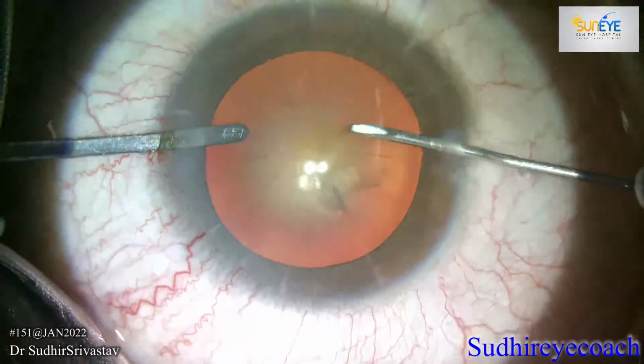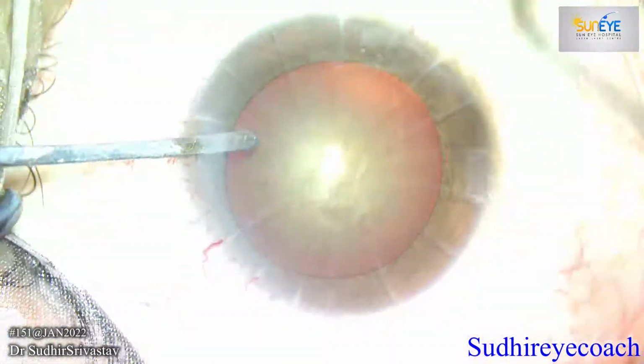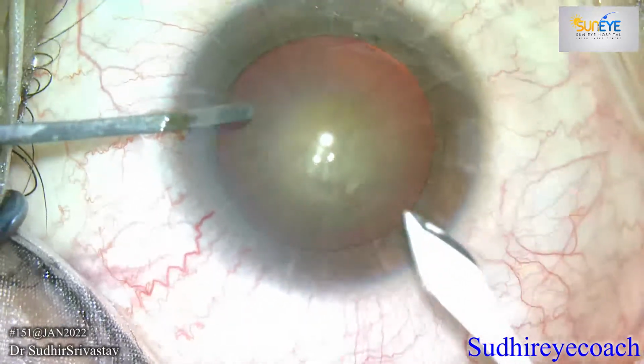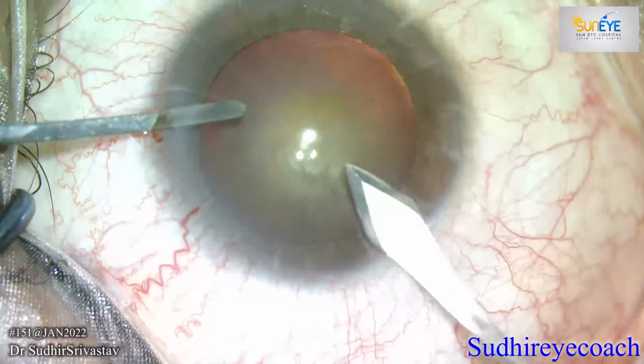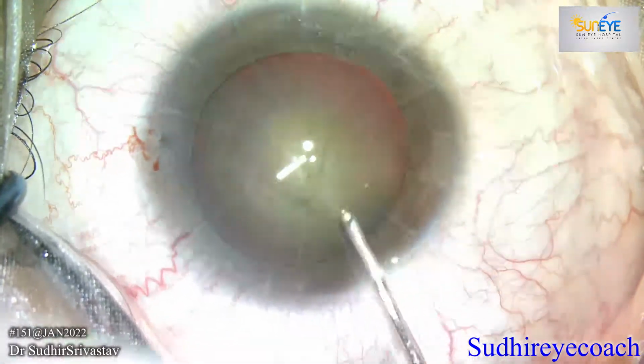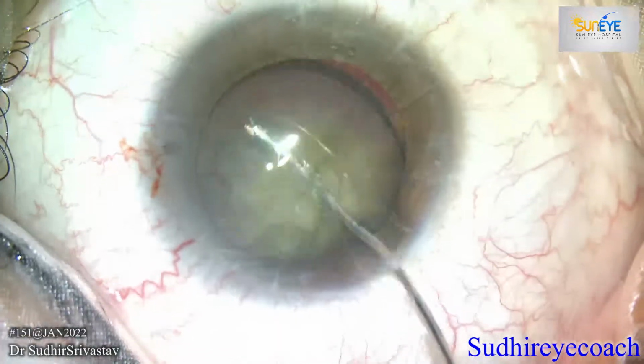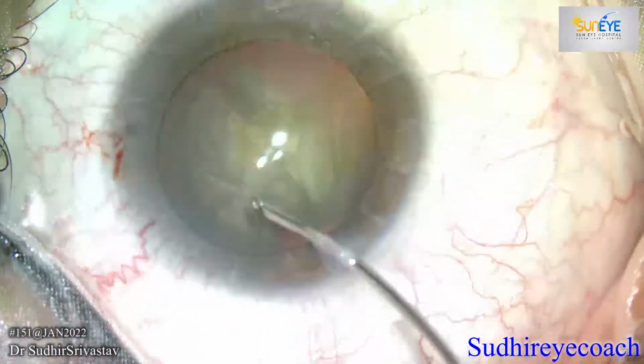Performing a capsulorhexis is not a difficult task, especially when you enhance the retroillumination. I placed myself in such a way that I can create a 2.2 millimeter clear corneal incision in between two previous incisions of radial keratotomy.